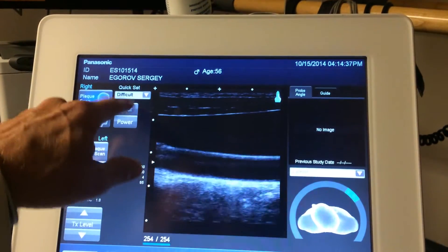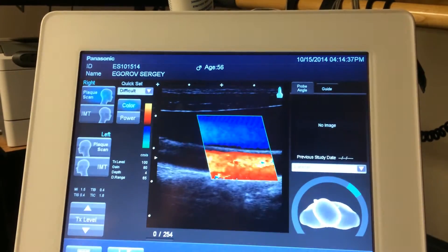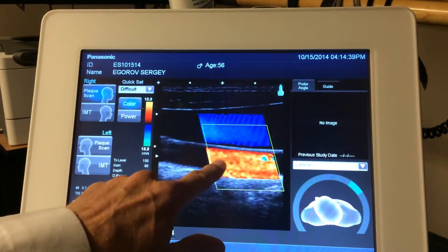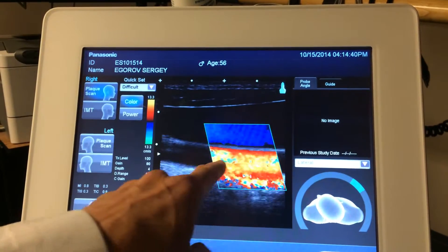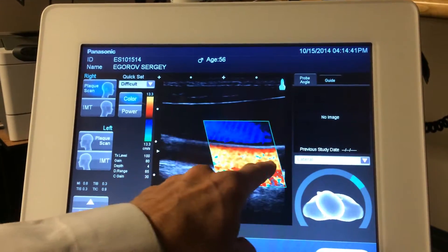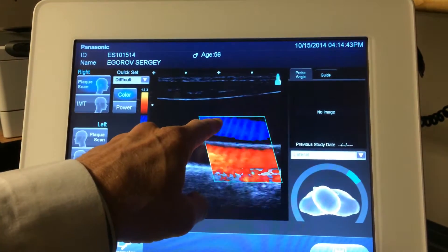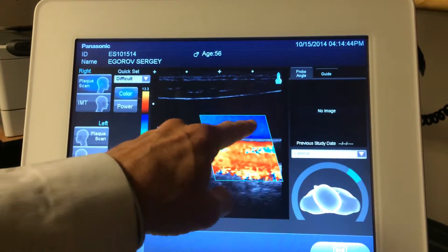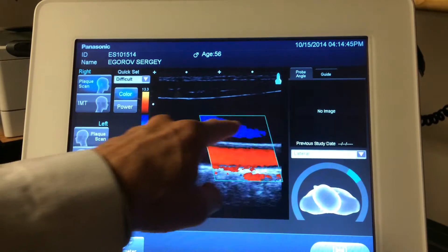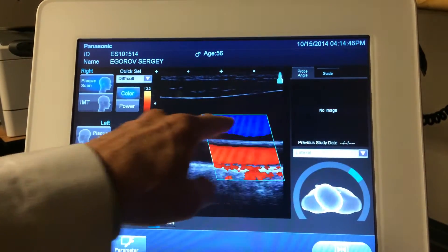So that's your carotid artery. If I turn on my color doppler, you can see your blood flowing in the artery here. Above it is your jugular vein. So that's the blood flowing in your jugular vein.